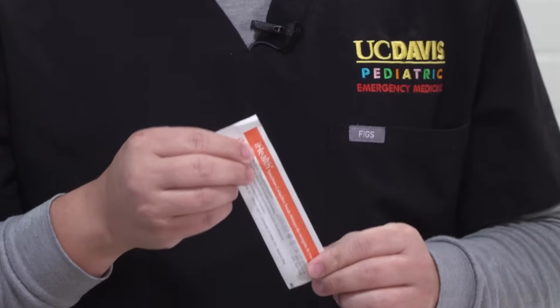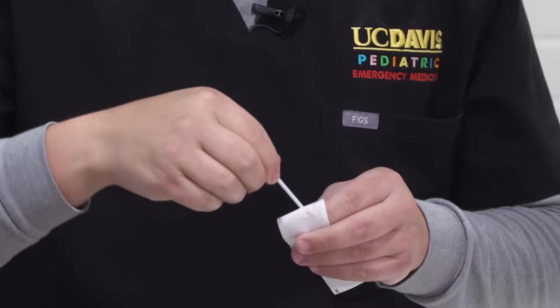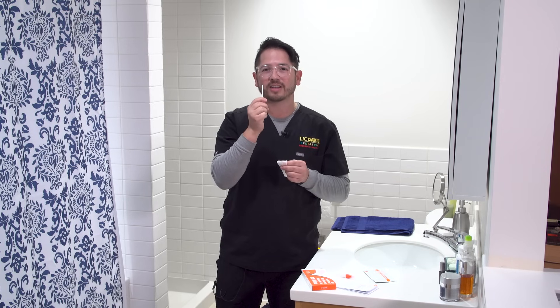The first step is we're going to use a collection swab to go into each nostril, rotating five times. You have to go about half an inch to three quarters of an inch. A great thing to remember is about the size of the tip of your pinky. One, two, three, four, five. Though it doesn't hurt, it does feel really funny. Now we'll go to the next nostril.